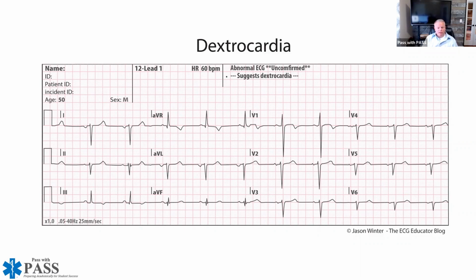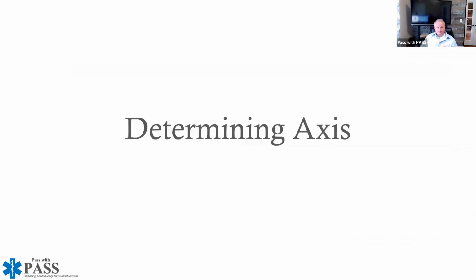So essentially you would end up doing your 12-lead EKG on the patient's right side versus the patient's left side. And if you do that, it kind of tricks the machine into thinking that things are normal, and it should give you a printout that you're now able to interpret. So it doesn't happen a ton, but there are patients out there. And as I said, we do have at least one here locally because we've taken care of him before.